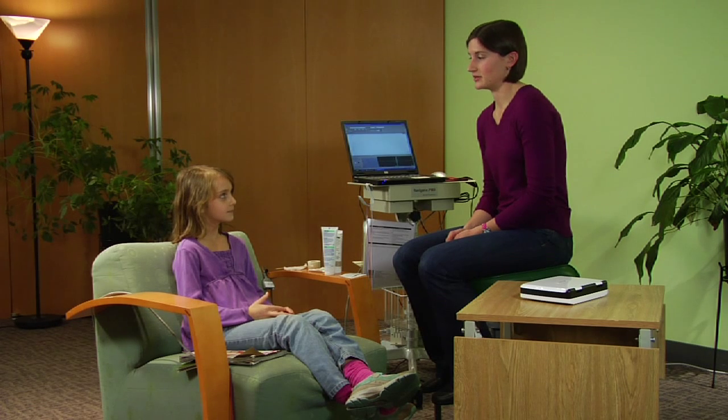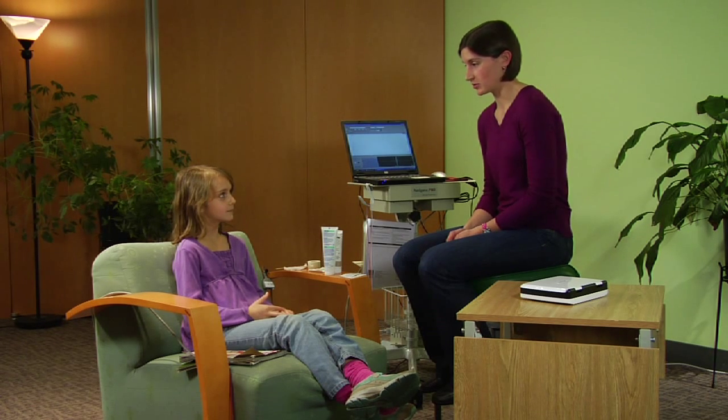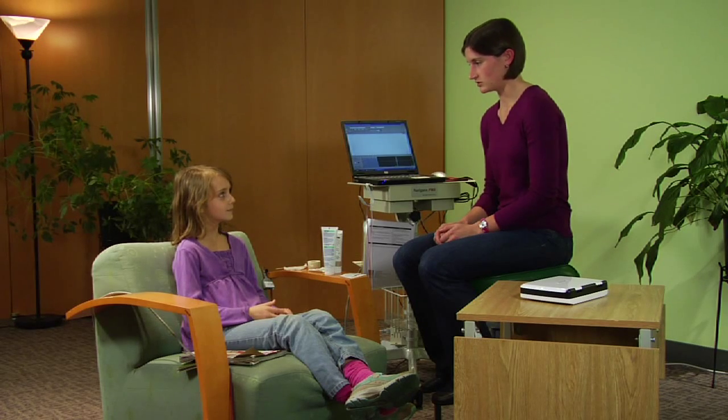Okay, so today what we're going to do is I'm going to measure how your brain responds to speech sounds. When your neurons talk to each other, they send out electricity, and I'm going to be able to pick up that electricity using these little electrodes. Then I'm going to play you special speech sounds in your right ear and measure how your neurons are talking to each other through those electrodes.